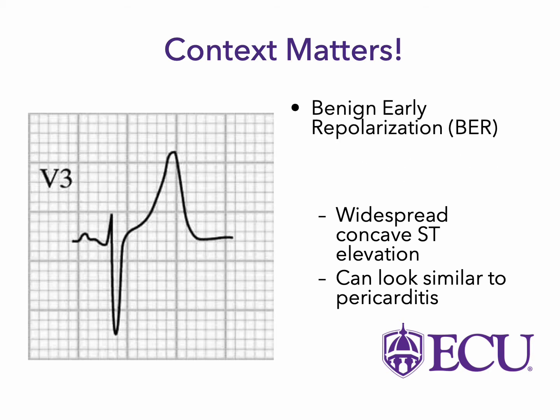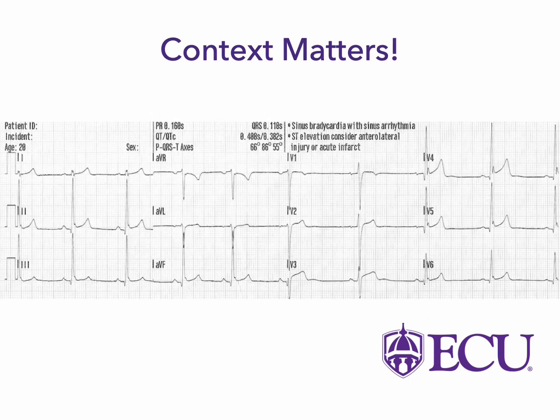So an example that we can look at. So looking at this EKG, right? Is this a STEMI? Is this not a STEMI? If I'm just eyeballing this thing, right? I'm like, oh shoot, there's some elevation in V2. There's some elevation in V3, definitely significant. See maybe a little bit out in the laterals as well. Maybe a little bit in AVF. This is a concerning EKG, but context matters, right?